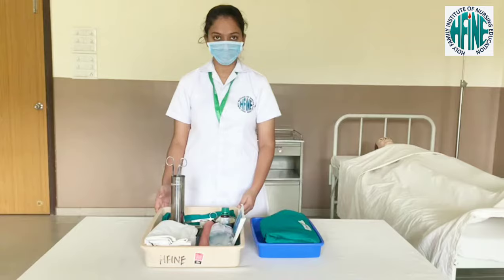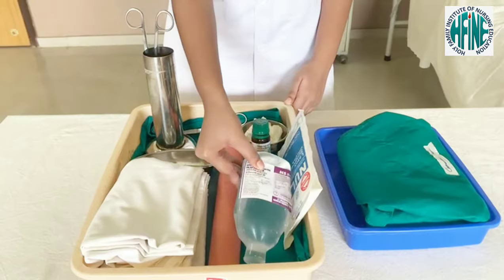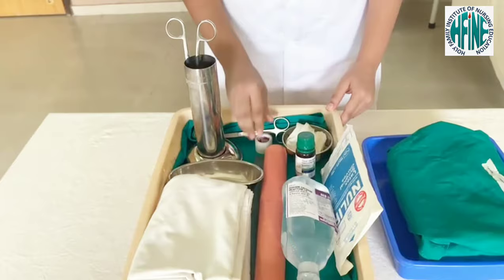A clean tray containing: iodine solution, normal saline, macintosh, clean gloves, sterile gloves, drapes, kidney tray, adhesive tape, and scissors.